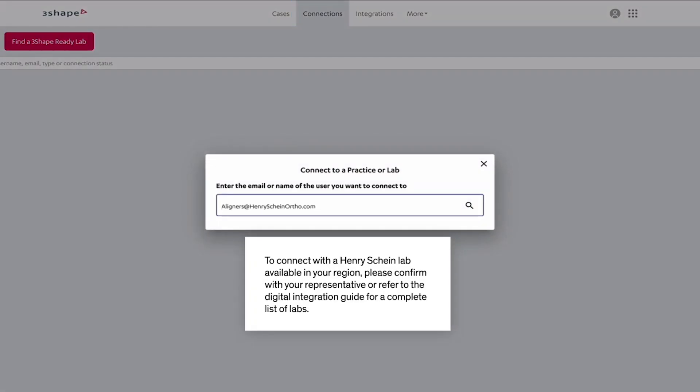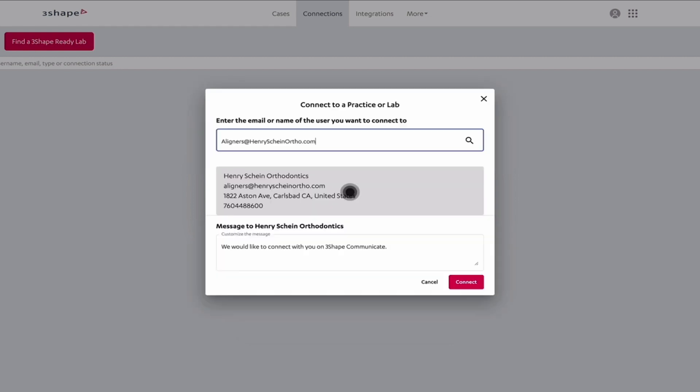Enter aligners at henryshineortho.com and click on the magnifying glass to search. Once the HenryShine Lab has been identified, click Connect.